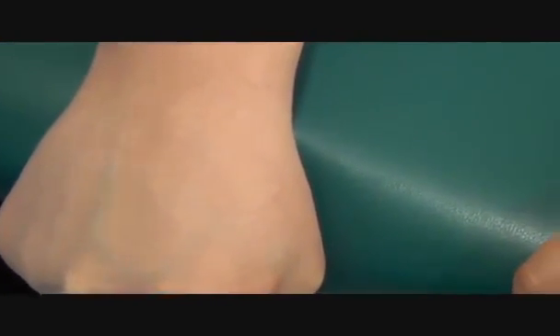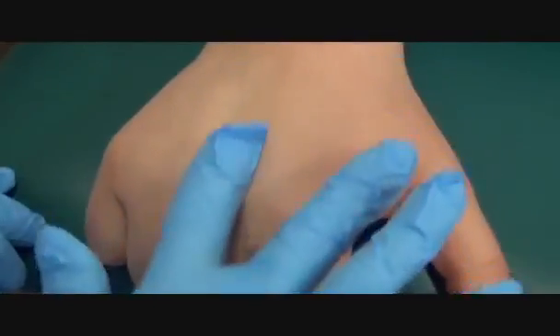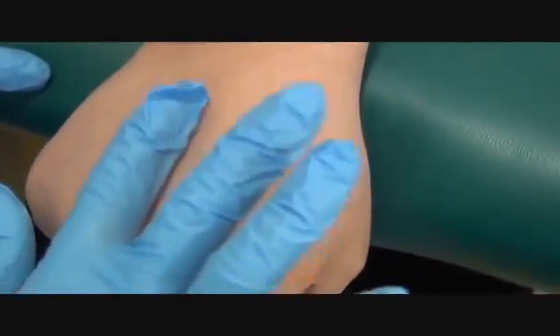Or you can ask the patient to make a half fist and then relax their hand — this makes the vein looser. This way is usually good if the vein is really big. So go ahead and make a fist again for me. Her vein is best that way so I'm going to use this style.